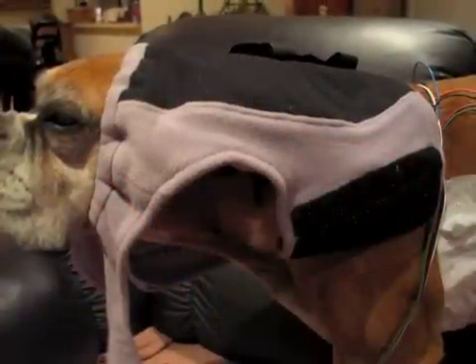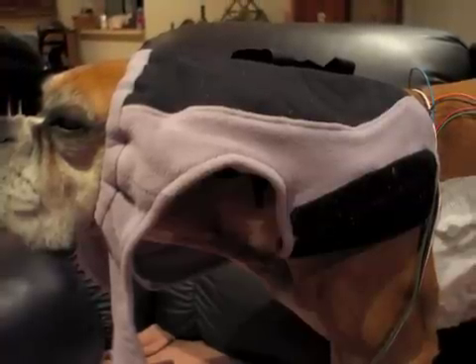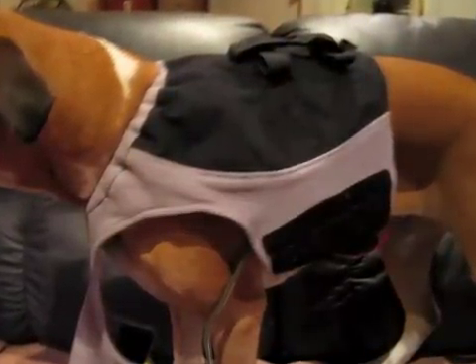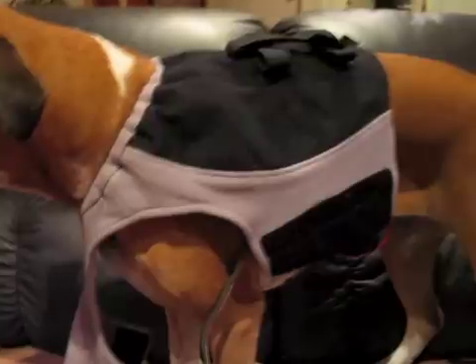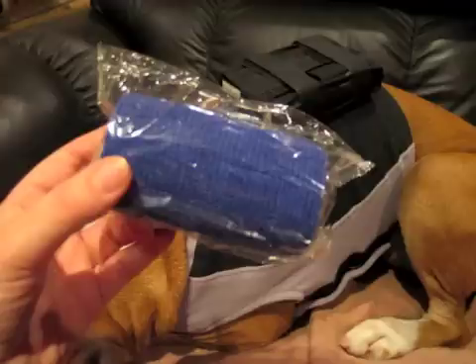This is the vest going on — it was made by Claire Perry, and there are lots of different varieties available for sale. This is putting the vest on over the wires and attaching it. This is tidying up now — a little bit of wire sticking out from behind the vest, so it's just a matter of tucking it in. The finished product: Rosie's very comfortable and happy in her vest, and the recorder is velcroed on top.